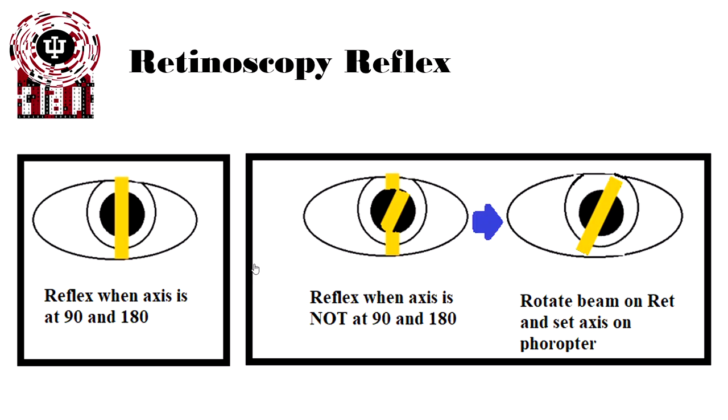Well, what is skew or scissoring? We've talked about prescriptions where the astigmatism axis and power are all at 90 and 180, so we're sweeping in the horizontal and the vertical meridian. When the axis is not at 90 and 180, and we sweep across, what we see is scissoring. Scissoring is what we see here in the center image, where the bar of light has been shifted off by some degrees in a different direction. And that's telling us what the axis of that person's astigmatism, the primary planes of it, is.